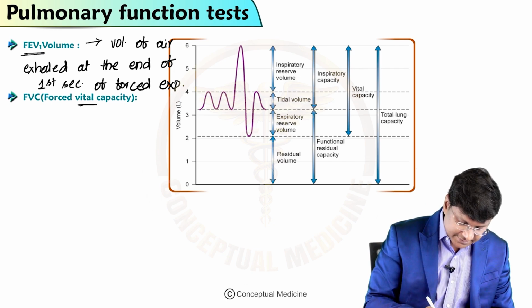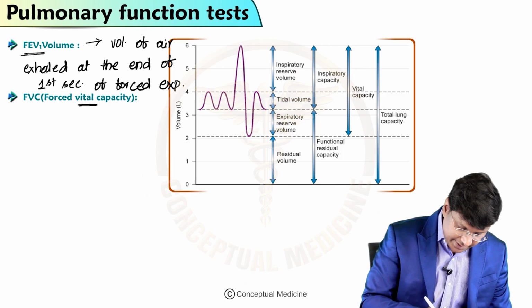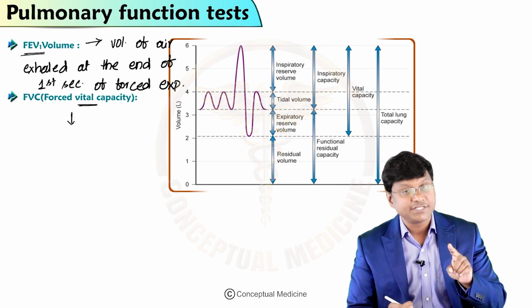And you take FVC, that is forced vital capacity. Forced vital capacity is the determination of vital capacity.